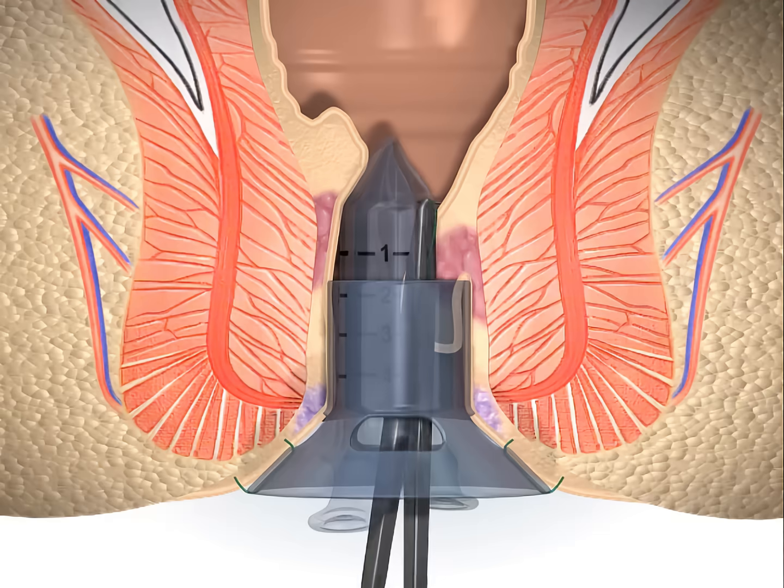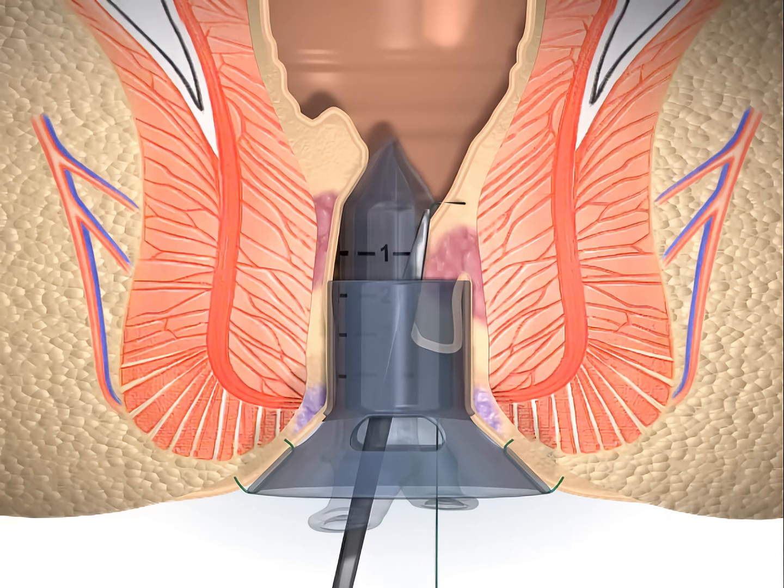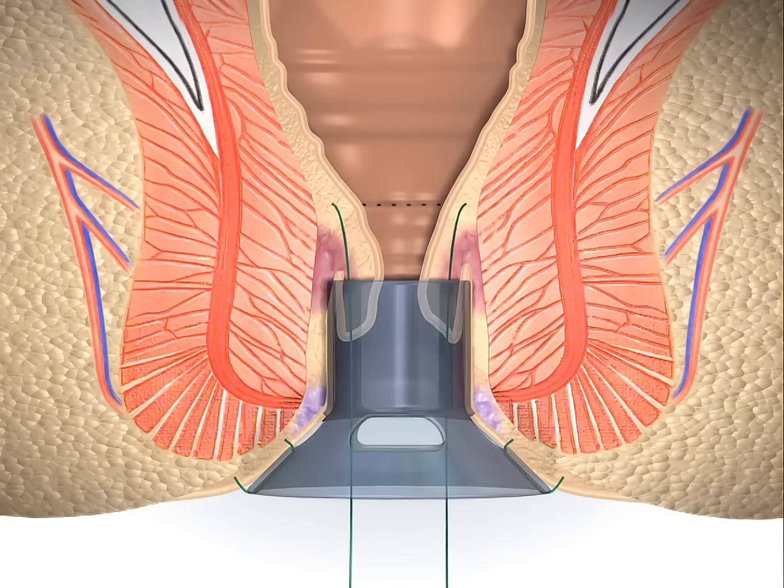Use of 2-0 prolene SH or monocryl on a UR6 needle is recommended for the purse-string. The purse-string sutures are placed close together, 6 to 12 small bites, to allow better traction of the mucosal prolapse. Each insertion of the needle is near the exit point of the last insertion.